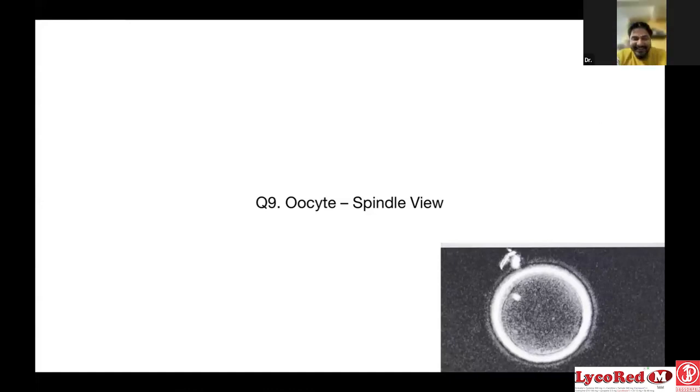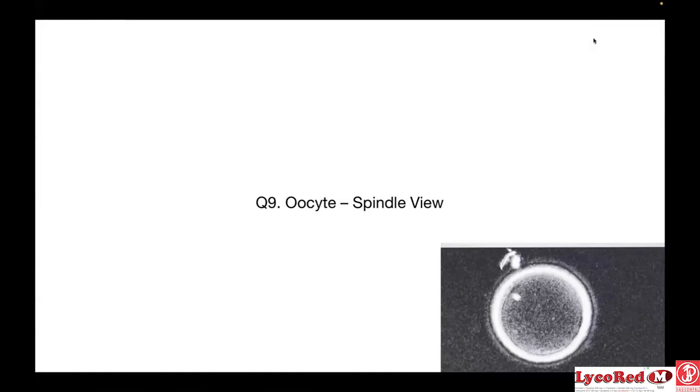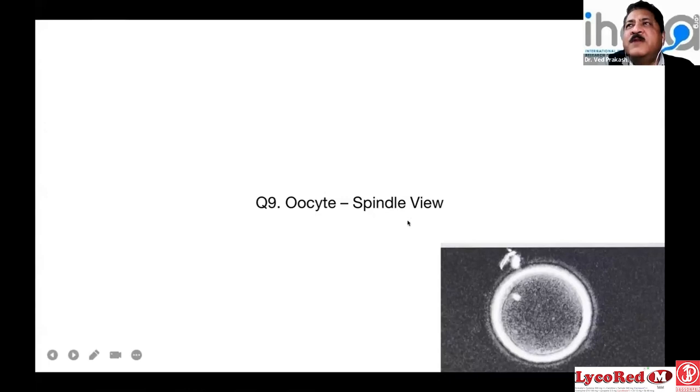No, Dr. Rishikesh Pai introduced that. Acha, in South India. The late Sudesh Kamath did lots of study on that, and I have heard him say that in frozen thawed oocytes, the placement of the spindle might vary, with some displacement. So in that case the spindle view would help, but that is his study. I have no personal experience. And Olympus also introduced a spindle view system, but it was not useful actually.